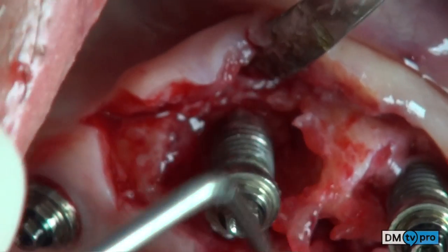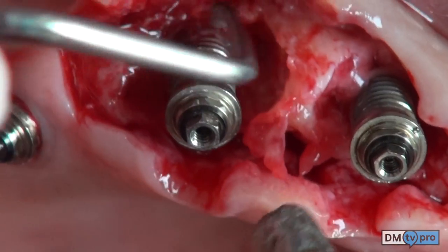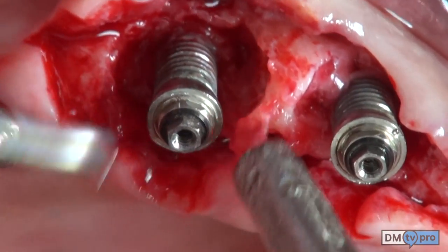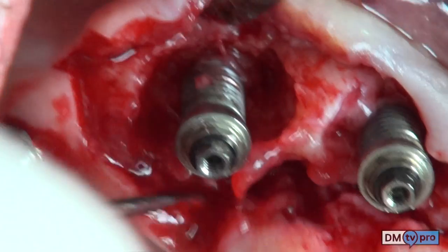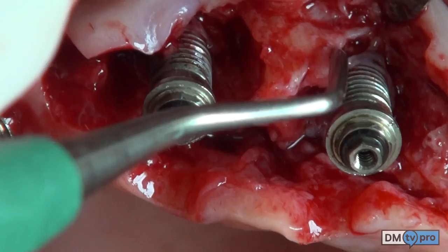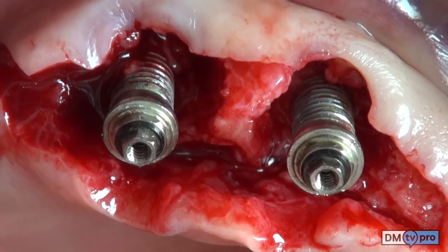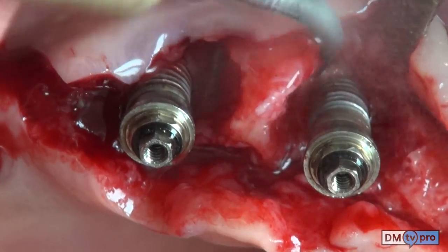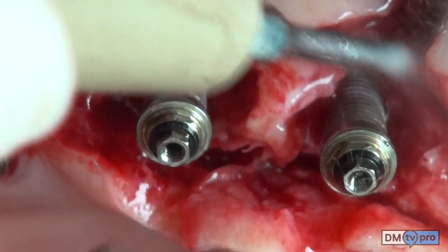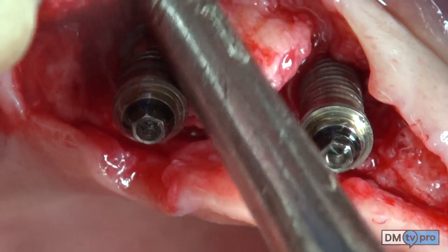The granulation tissue is removed by means of an alveolar curette. In the narrowest spaces, an M23 scaler is used to remove the granulation tissue. After each manual instrumentation, an ultrasonic instrumentation is performed as well.